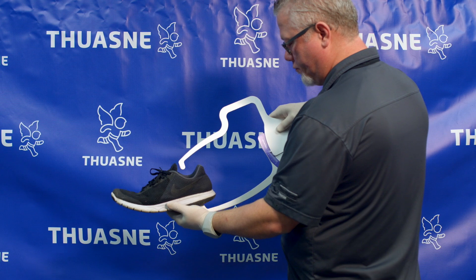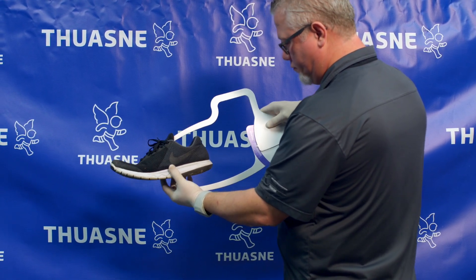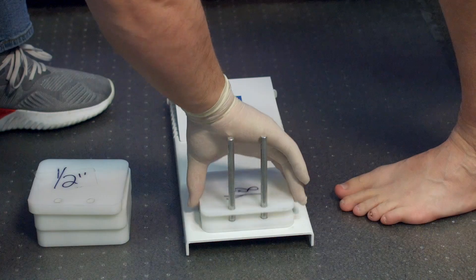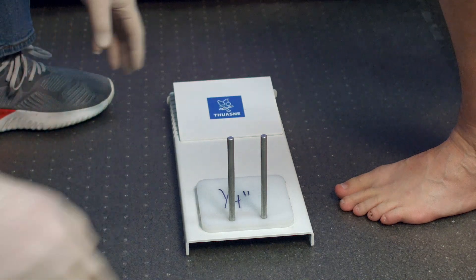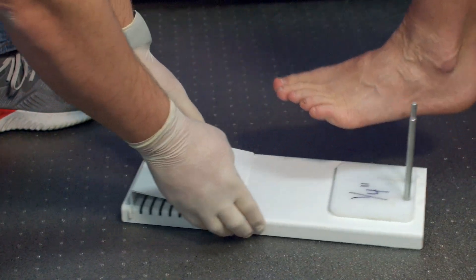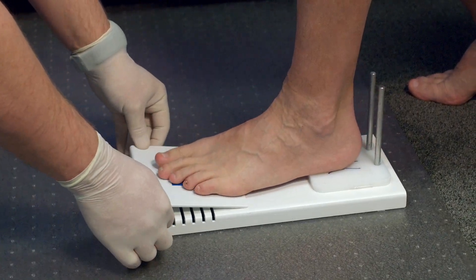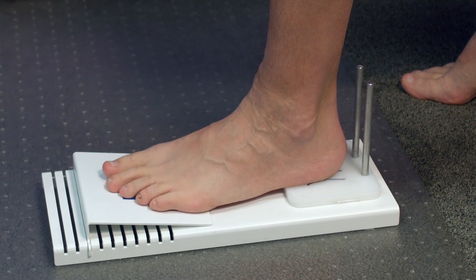Before starting the casting, measure the heel height and forefoot height of the patient's shoe. This will determine the height needed on the casting platform. In this example, we will use 3/8 inches by placing a 1/4 inch block and a 1/8 inch block on the poles of the casting block. Place the toe ramp at the metatarsal break. Make sure the heel doesn't touch the poles in order to maintain the shape of the cast.